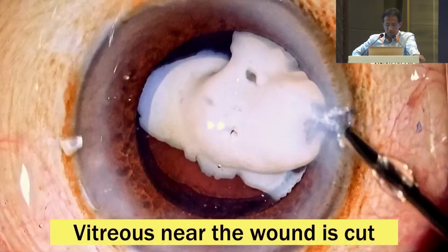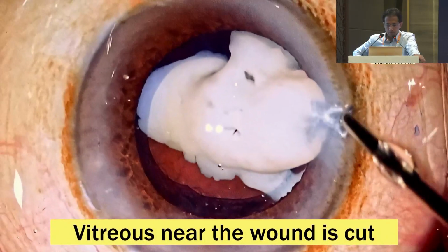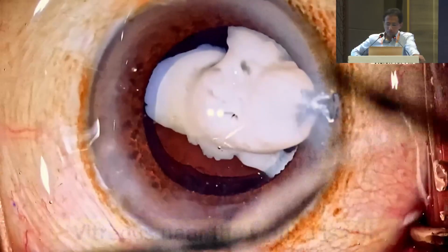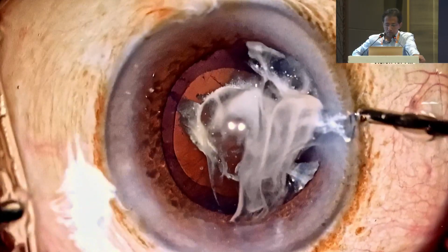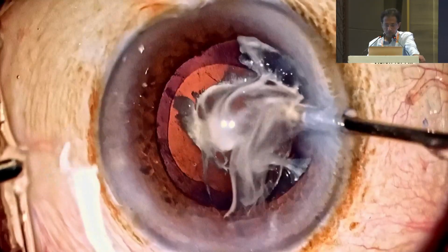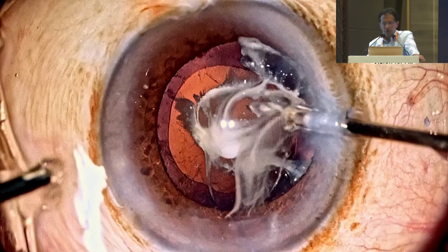Now let's have a step-by-step approach of managing this case. The prolapsed vitreous near the wound is first cut with the vitrector. Then the cutter is introduced into the antechamber, which is currently maintained by OVD and the prolapsed vitreous. At this point, you can note the chamber is filled with OVD. I'm not introducing my irrigation cannula yet. The first thing which goes in is the cutter itself. It takes care of all the vitreous which is near the wound.